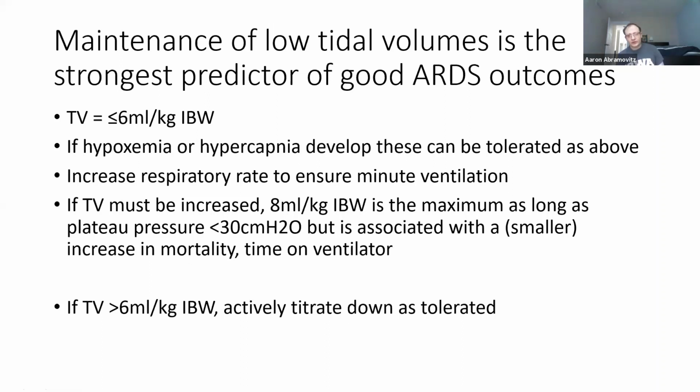As we saw back in the physiology part, acute lung injury occurs when you have high tidal volume, high pressure, and the amount of injury is dependent on the amount of time that they're experiencing that. So, sometimes you run into a spot where they just won't oxygenate or won't ventilate with a tidal volume of less than 6. Bump it up, see what else you can change to improve things, paralytic, pronate, etc., and then come back down to the 6, protective lung ventilation.